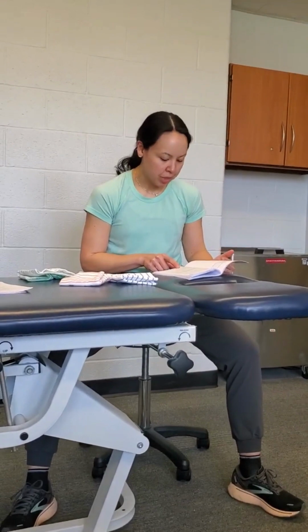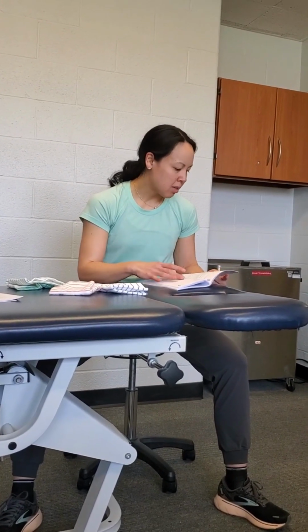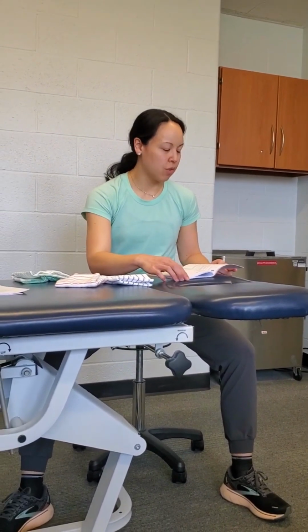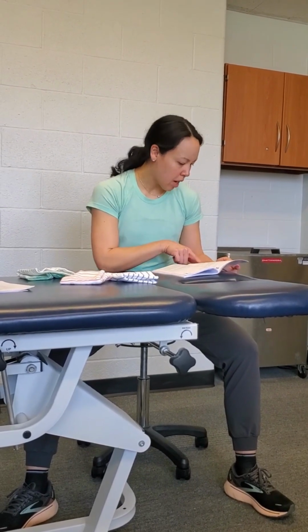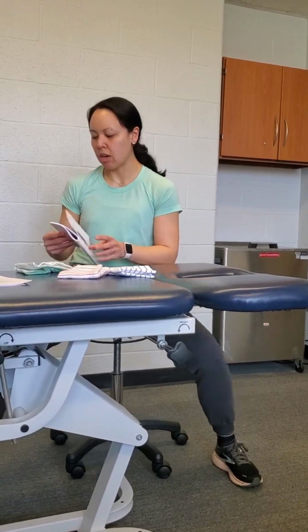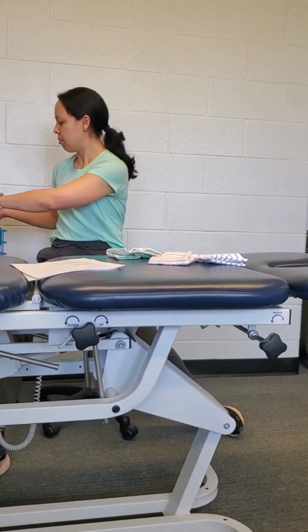So we just want to be cognizant that the patient is stable and safe, right? And then other factors listed are uncontrolled diabetes or sickle cell disease or trait. That's more in the precautions section versus being contraindicated. And then it goes on to list the precautions, and there are also some risk factors that I'll go over as well, but for the most part this is a nice little reference and it should stay with the machine at all times. It also goes over how to use the device, but we'll talk about that today.